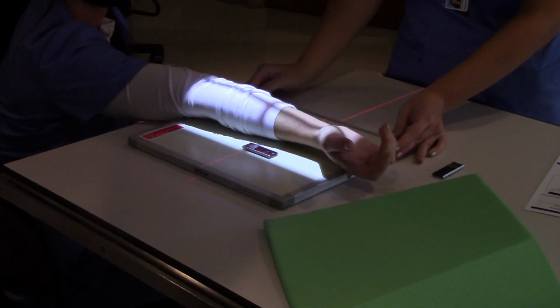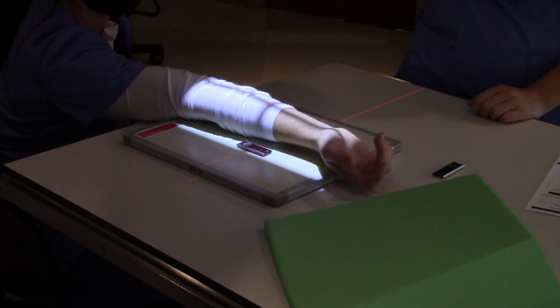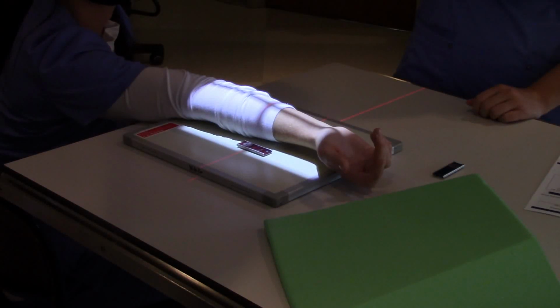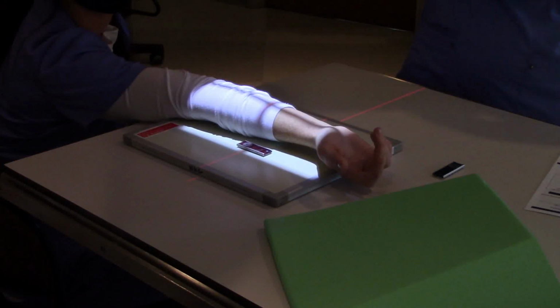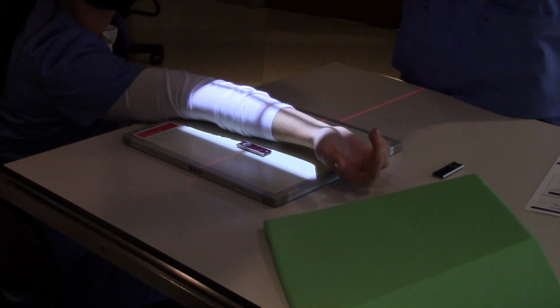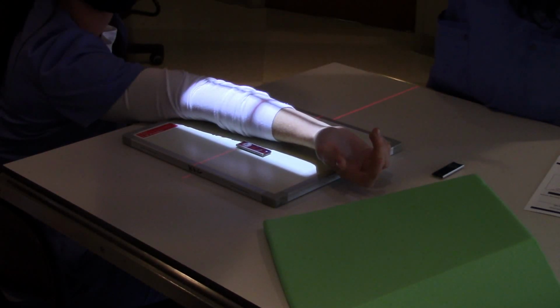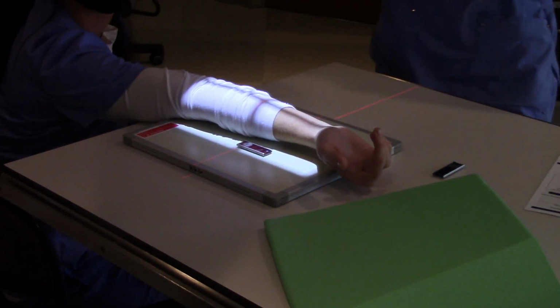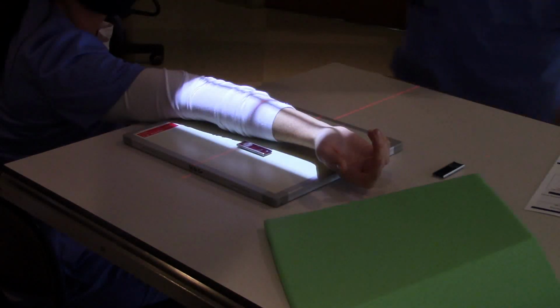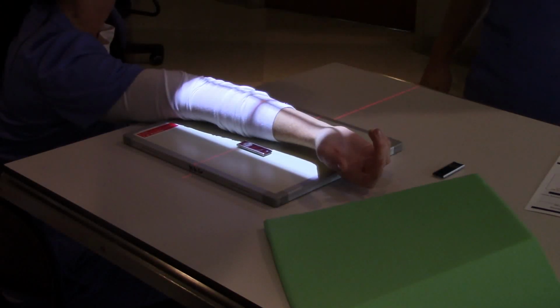Maybe I go up now. Like that? Yeah. You can either move your image receptor and your, now are you centered to the IR? It looks pretty good. Move it a little bit. It's like that tube is stuck in concrete. Is that better? It doesn't want to budge. Yeah, I think so. So you gotta make sure your elbow's in there. You want to make sure you include that elbow joint.